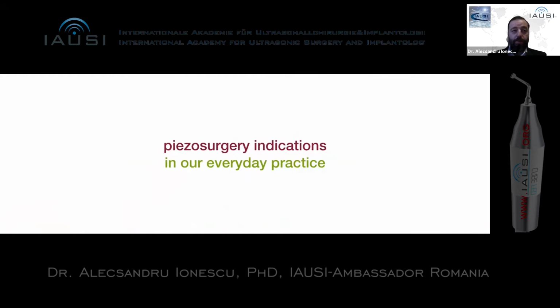Okay, I agree, we can do almost everything without piezo surgery, but we have so many advantages, and there are some cases, for example, when you have a stubborn root that cannot be taken out without fracturing the bone walls, then you just take the piezo, you cut the root out, and then you preserve the bone, and you have no stress in the future steps when placing the implants.